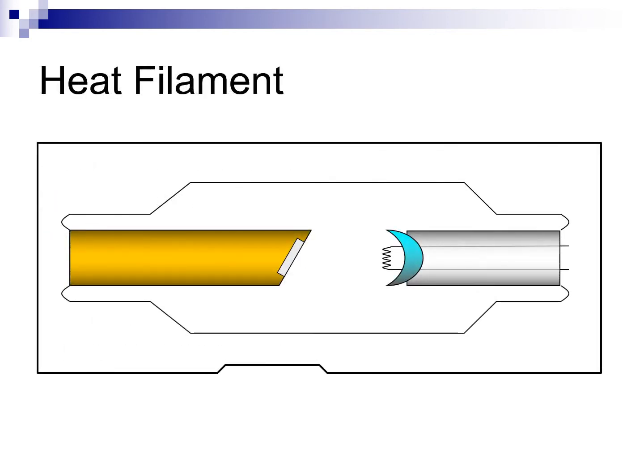To begin the process of producing X-rays, the filament, a thin coil of tungsten wire, is heated until white hot. As the filament heats, electrons boil off its surface and form an electron cloud around the filament, called thermionic emission, which translates to producing electrons using heat.